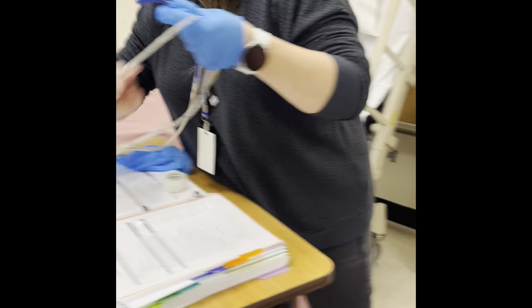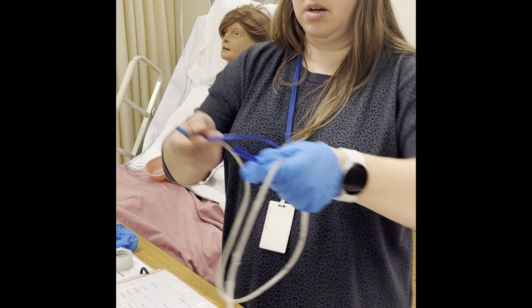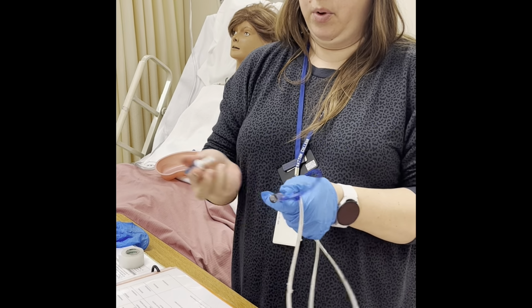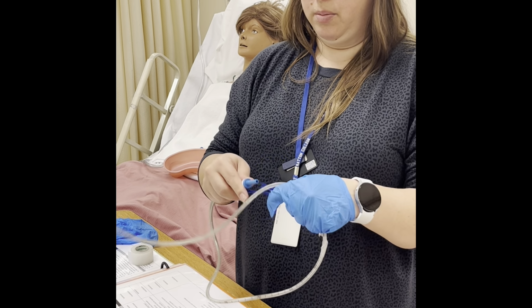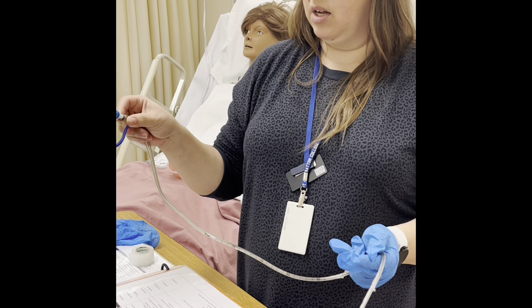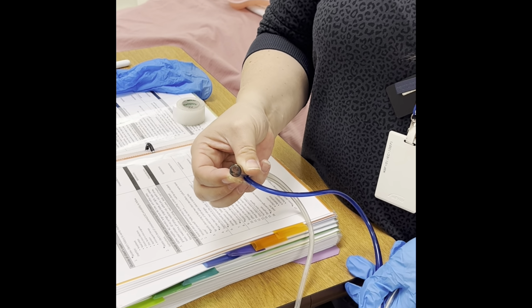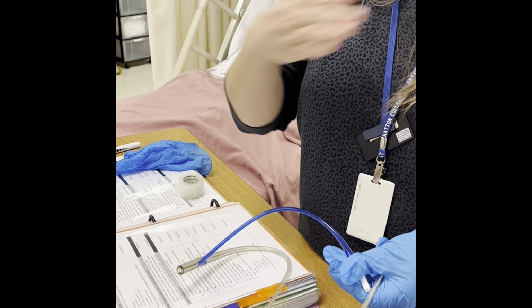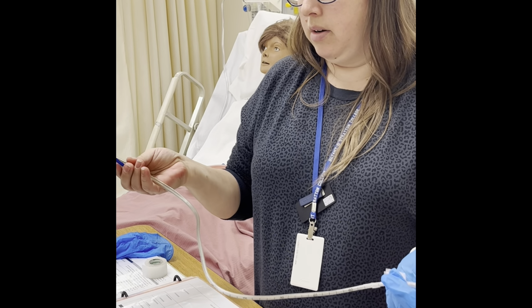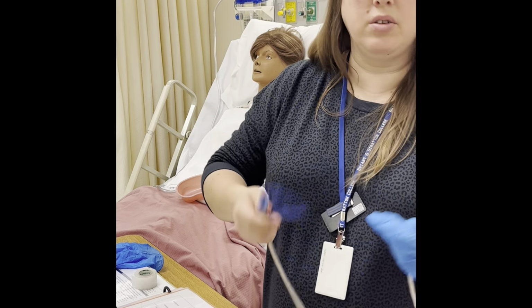Then we're gonna take this blue and white cap and we're gonna put it on here. Why? Because when this tube goes in, we don't want stomach contents shooting out the bottom of the tube and all over our patient or all over ourselves. So clear to white, blue to blue. You want to make a little loop. Can you see it kind of on the white one? There's like a little hole. That's a vent. That's not actually the tube. It's a vent, again, for gas that comes out. We don't want this blocking this, because then what? Besides your patient attempting to burp, there's no gas. It's all staying inside.